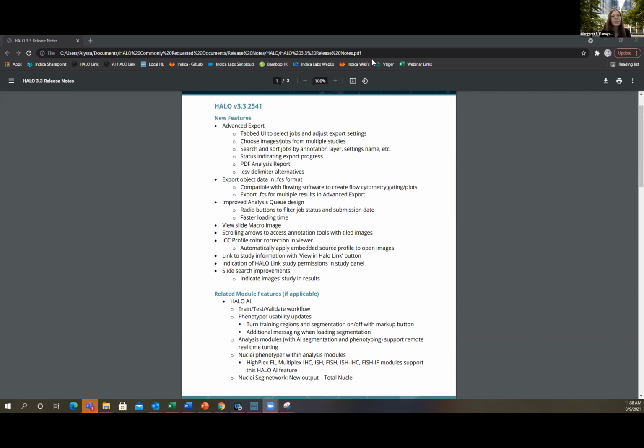Thanks so much. That's great. So I don't see any questions quite yet, but I could start with one of my own questions. Just from some of the more experienced Halo users, can you comment on, it looked really nice, Jeanelle, when you were showing the colocalization specifically for the two different markers. Do you do that with the co-registration, or are you doing multiplexed DAB staining for that?